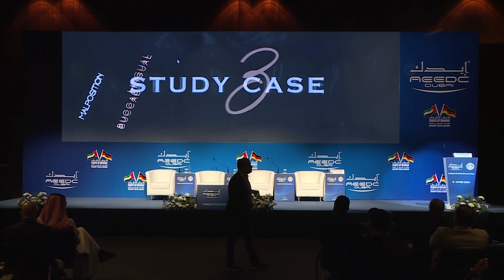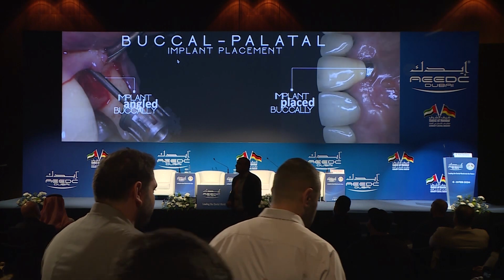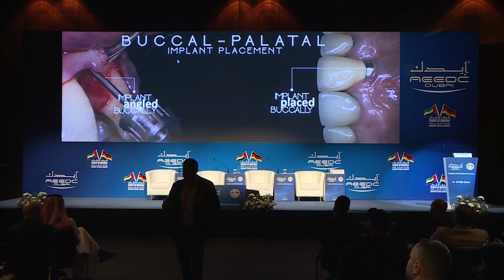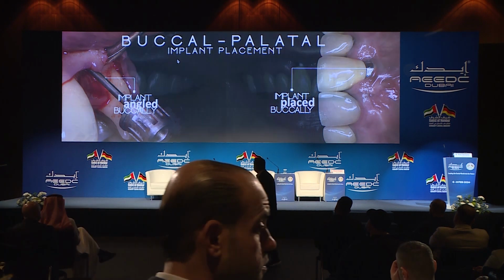What if you place your implant in a wrong buccolingual position? This is very common if you're doing immediate loading. At the time when I started doing immediate implant placement, my teacher used to tell me, go to the palatal bone, go to the palatal bone. And when you go to the palatal bone, this is what happened. Your implant is too far to the palate, so it comes out too buccally.